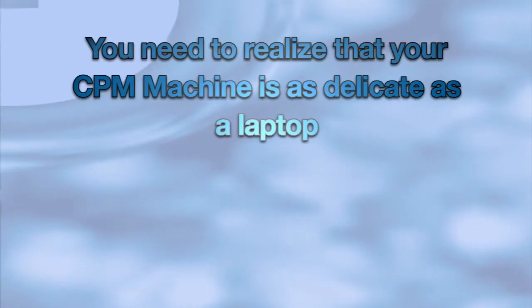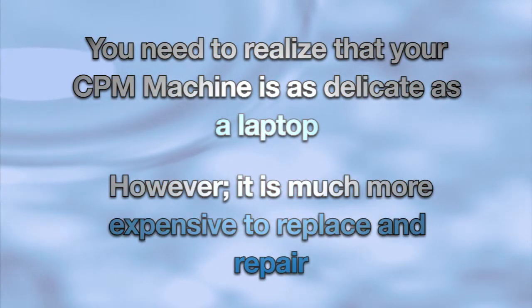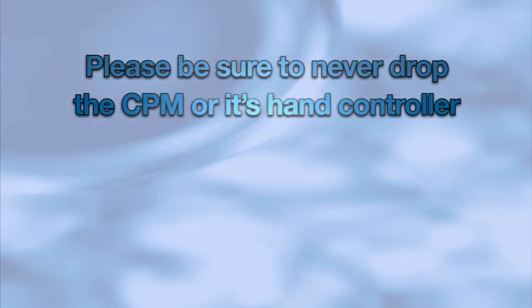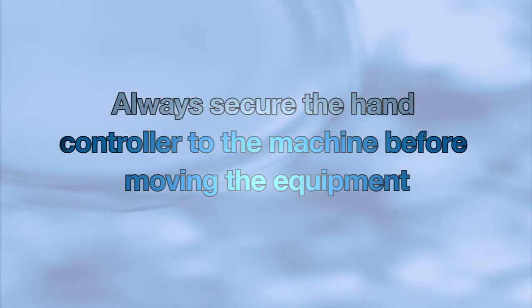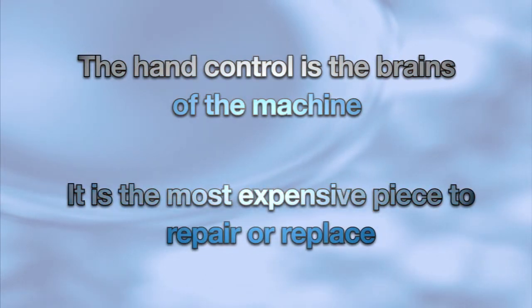Okay, so you need to realize that your CPM machine is as delicate as your laptop computer. It is, however, much more expensive to replace and/or repair. It is crucial that you take good care of your CPM to keep it out of the repair shop and running for years to come. A properly cared for CPM machine can often last well beyond 5 years. Please be sure to never drop the CPM or its hand controller. Doing so may cause permanent failure. Always secure the expensive hand controller to the machine before moving the equipment. The hand controller is the brains of the machine and is the most expensive piece to repair or replace.